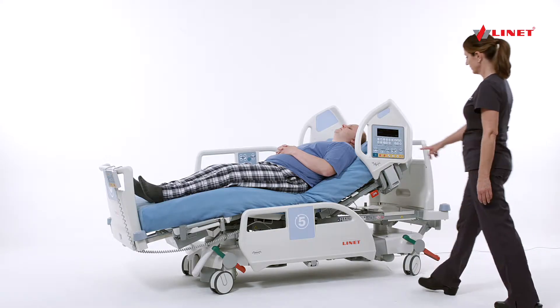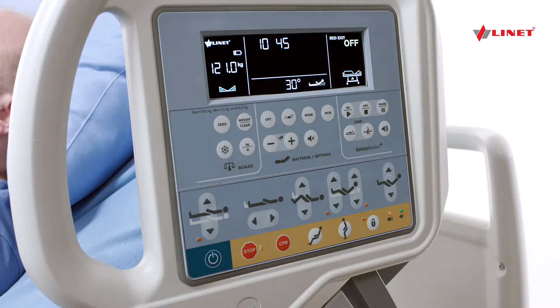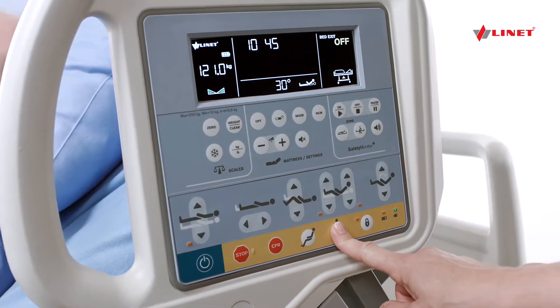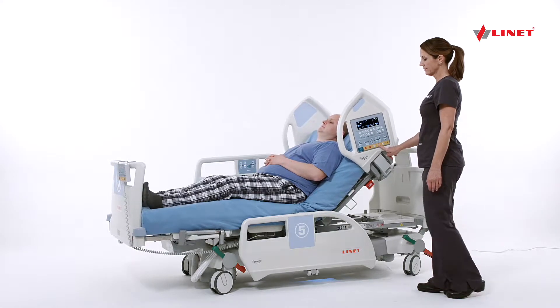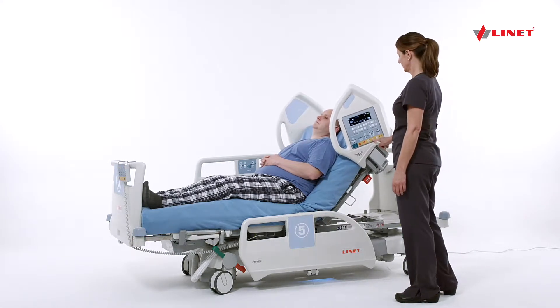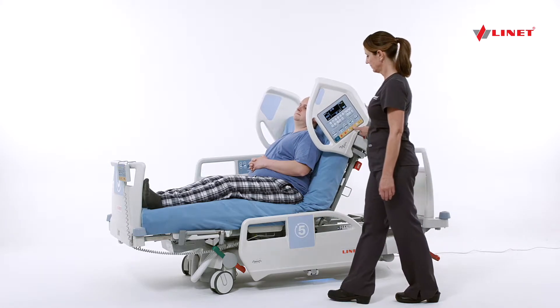To bring the bed to the mobilization position, first press the green go button, then press and hold the mobilization button on the iBoard panel. Mobilization can be performed in combination with the side rail override feature and lateral tilt for egress and ingress of shorter patients.